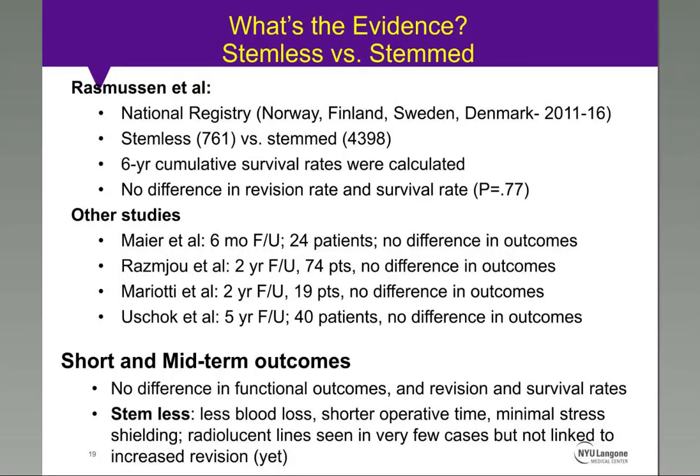So let's go to the evidence of stemless versus stem. There are mainly short and midterm follow-up studies that demonstrate that there are no differences in the functional outcomes and revision rates between the stemless and stem components.